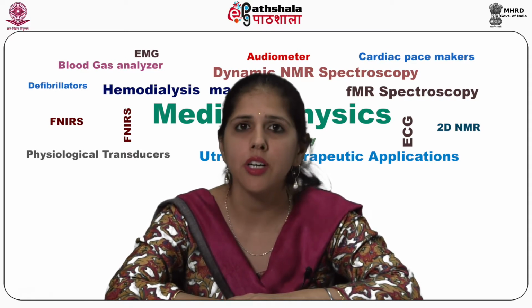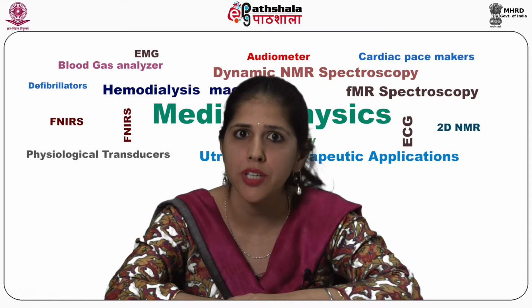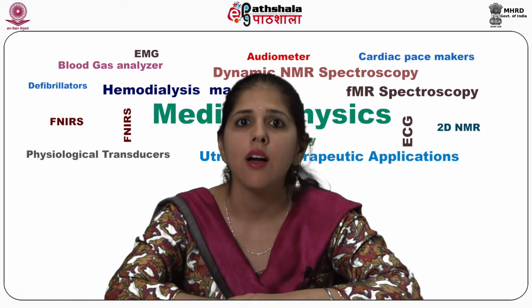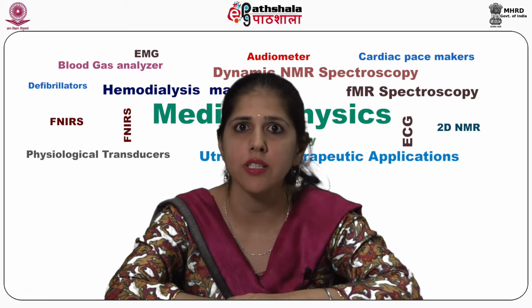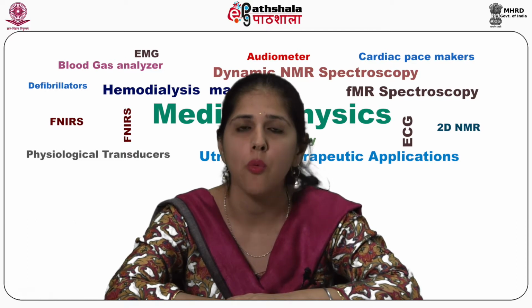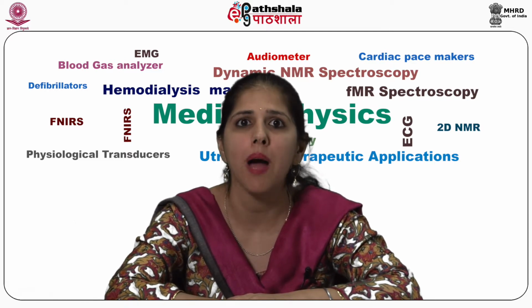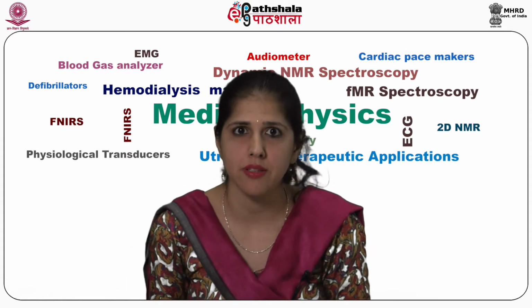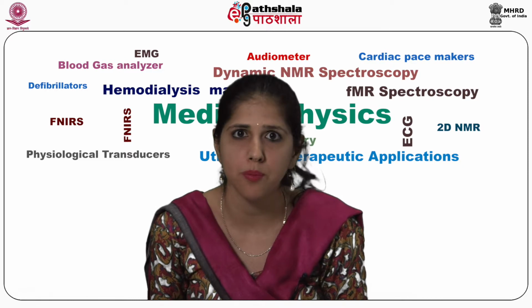diffusion. The third thing that is very important for the process of diffusion is temperature, because temperature determines the movement of molecules. If the temperature is high, the molecules are more motile, and there is a higher chance of them diffusing across the membrane. But we need to ensure some things, because this is a biological process that we are discussing. If we heat the solution too much, what will happen? It will become incompatible with the patient's blood, because we would damage the blood cells and denature the proteins.